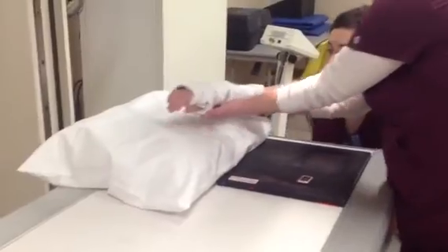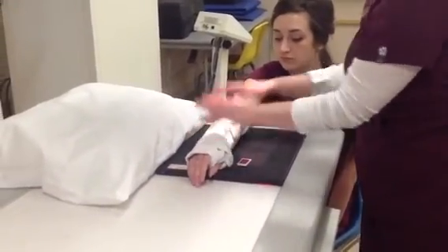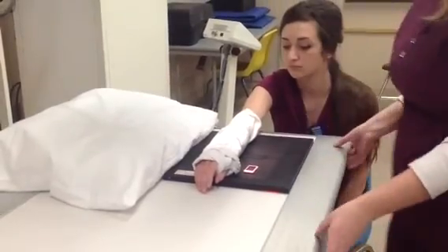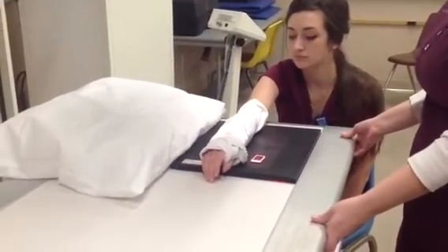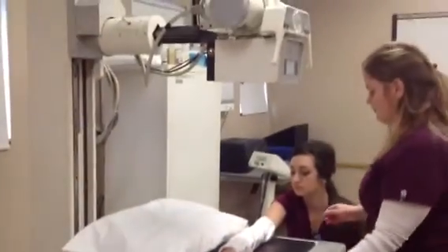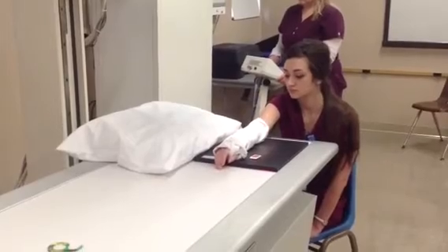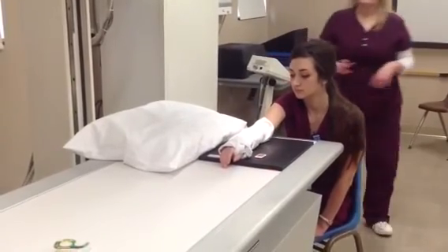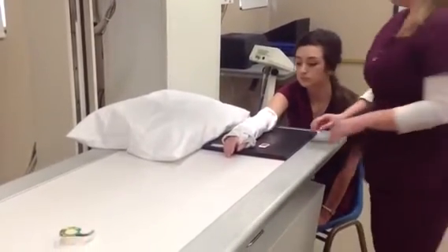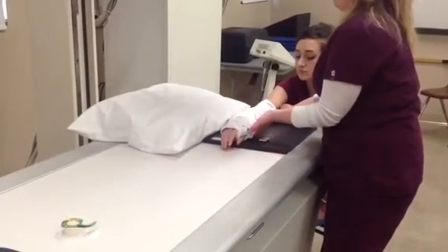Always remember to be gentle during an exam on a casted patient. Be sure to use the proper techniques to position the cast with open hands, offering support at joints. When imaging extremities that are casted, be sure the entire extremity is on the same plane. Always place your marker and perform your exam as you normally would to the best of your abilities in regards to your patient's condition.